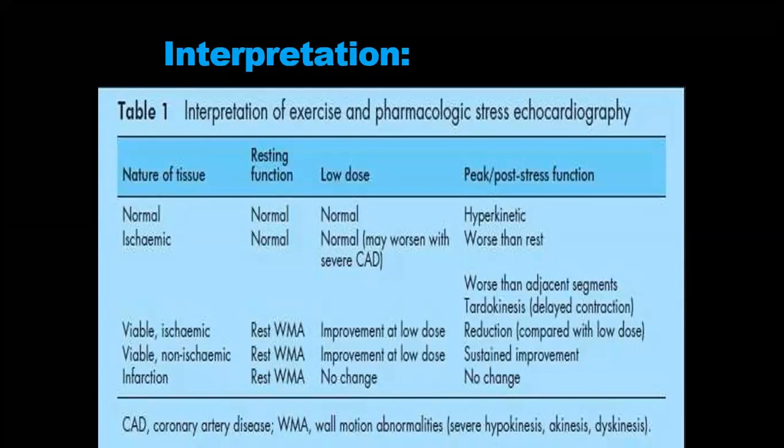When an abnormal dobutamine response occurs, we should bear in mind two things: there may be stenosis in the regional segment, or the segment may be stunned or hibernating.